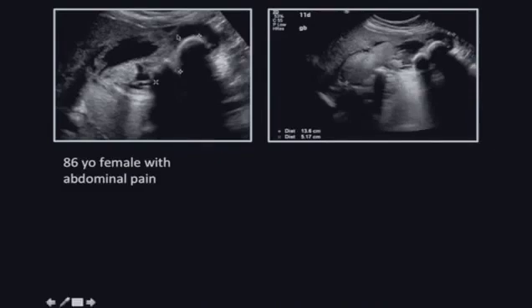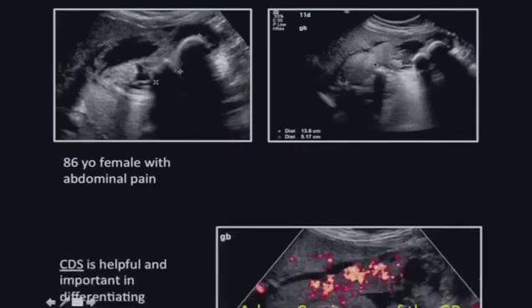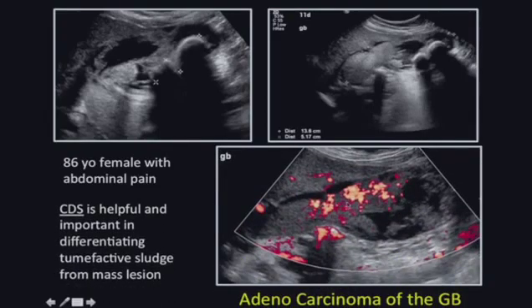This patient presents with pain again, older patient. The gallbladder has multiple gallstones. There is soft tissue within the gallbladder. Is this sludge, debris, or is that mass? Color Doppler sonography is the key here that shows the neovascularity of the lesion within the gallbladder lumen, indicative of gallbladder cancer.